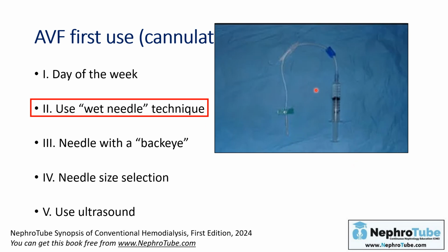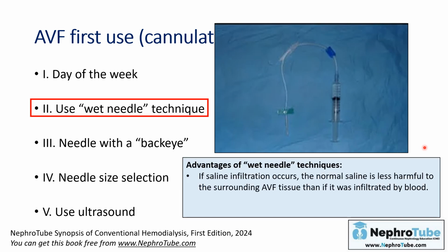What are the advantages of using the wet needle? Why not use the needle without the saline? We are calling it wet needle because of the priming we did for the needle with saline. What are the advantages of this technique?